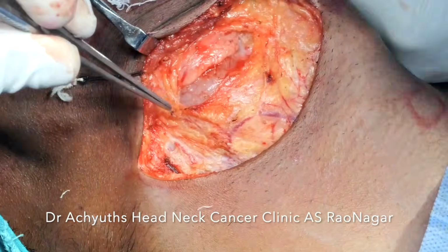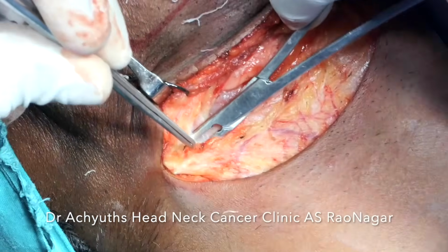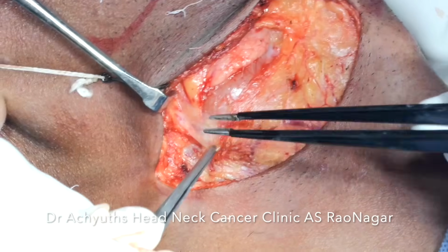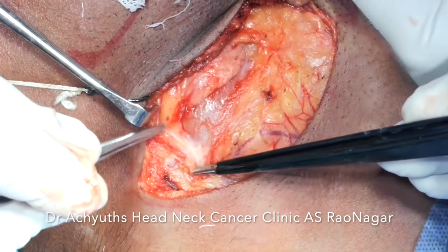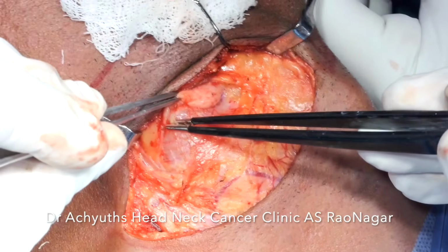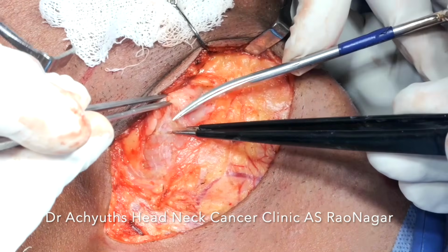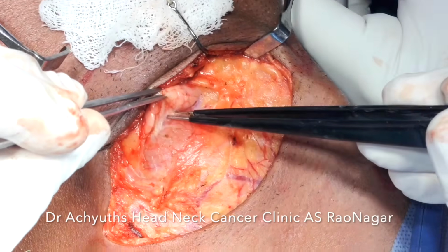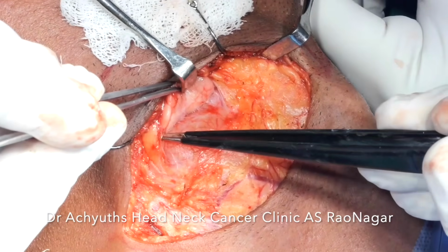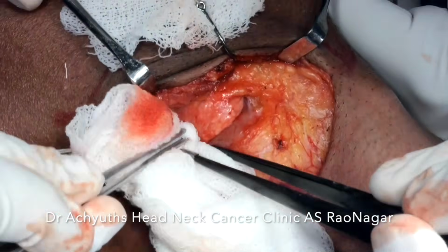Superiorly, the submandibular gland, it is not necessary that we divide the submandibular gland or excise the submandibular gland. So here, thankfully in this patient we did not encounter the common facial, but otherwise sometimes common facial is encountered which is going into the submandibular gland, which needs to be clip ligated or suture ligated sometimes, but here it was actually going into the external jugular vein, so it was placed much later. So when we are lifting the submandibular gland, now you can see that the submandibular gland is being lifted. Here we did not get any common facial.